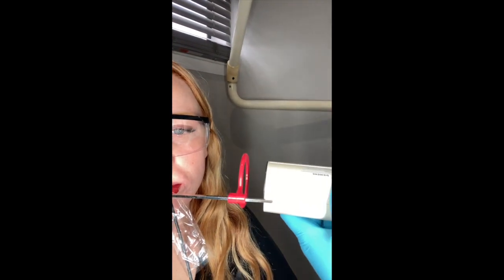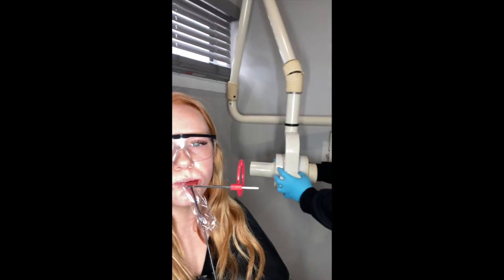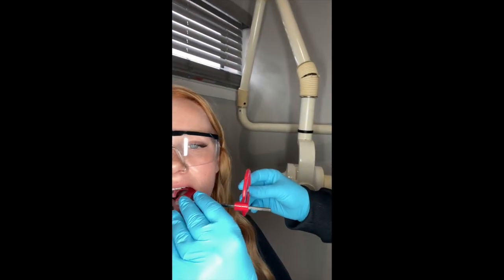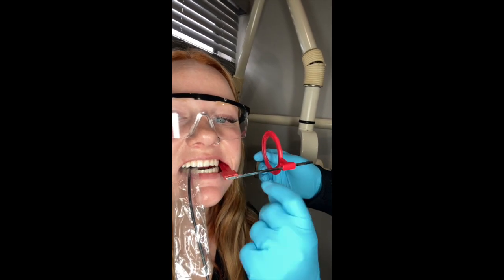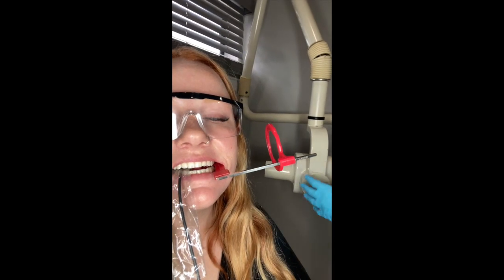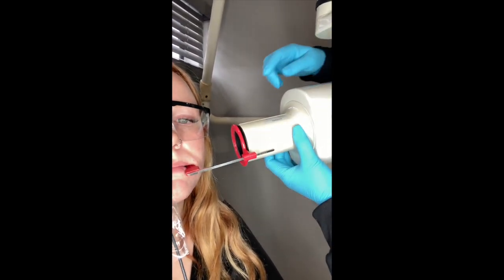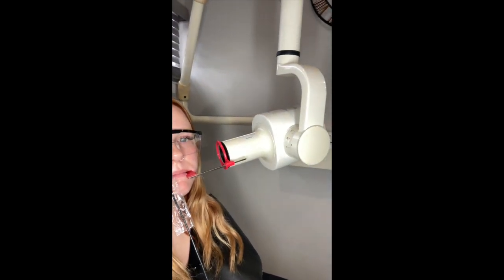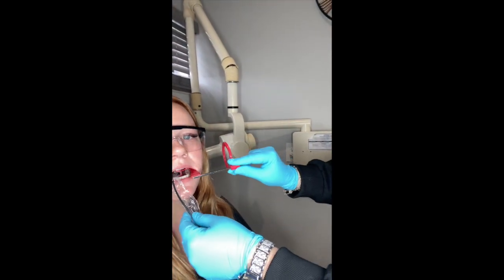We place our unit parallel. We're not going to take it out — we're going to go straight back. Gently bite, and we can make sure that we have the distal of her last molar. Everything needs to be nice and parallel. There's a little line up here and right here — we line those up, and that would be our four bite wings.